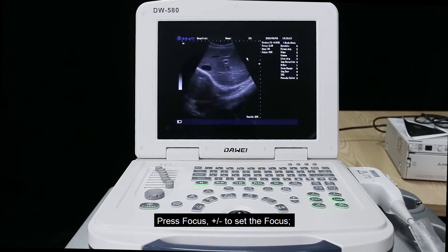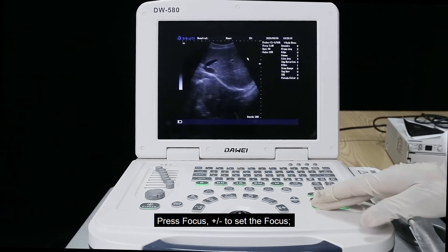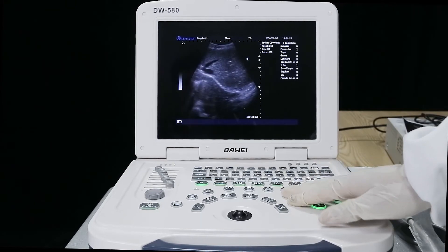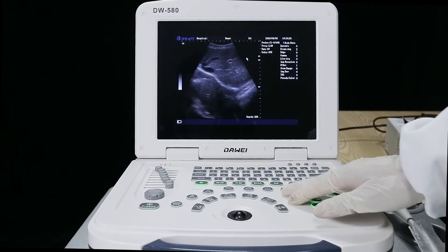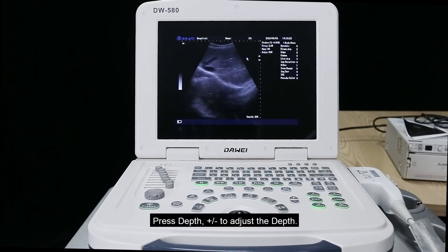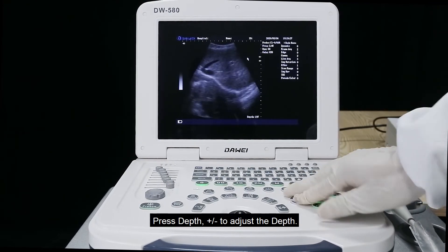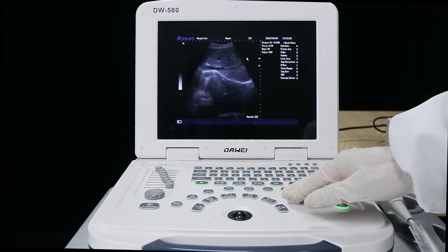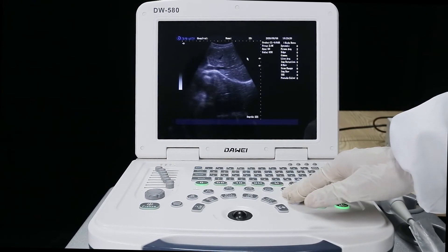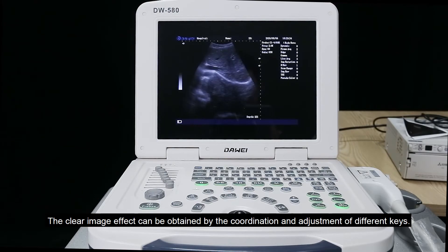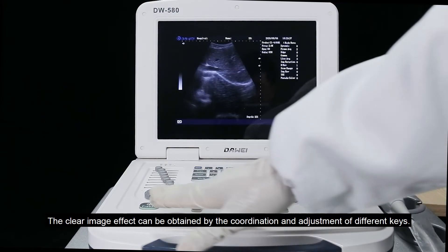Press line plus or minus to adjust the linear density. Press depth plus or minus to adjust the depth.